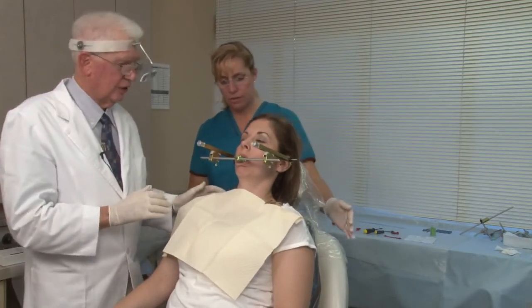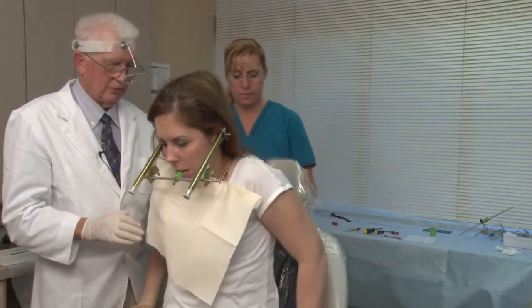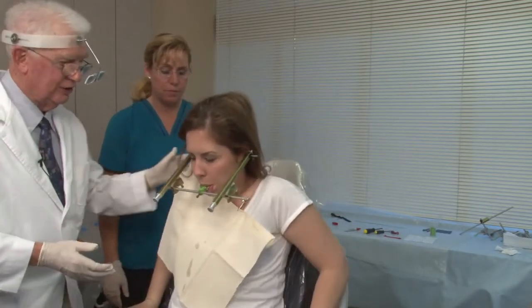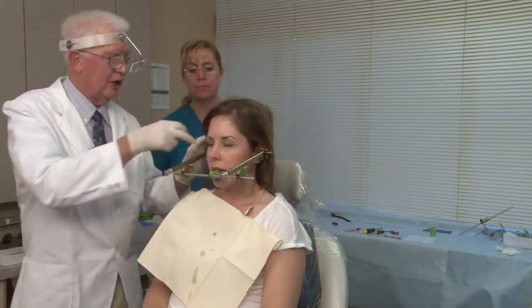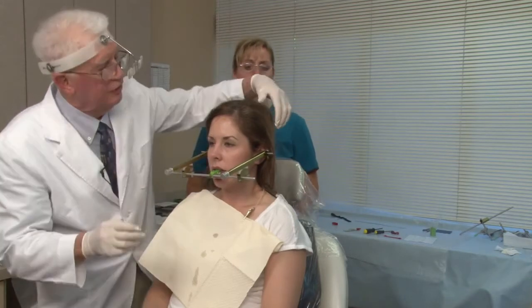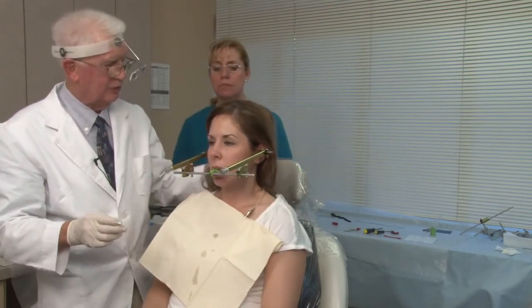Is that it? Okay, now I'm going to have the patient scoot your bottom back against the chair. Feet, no, don't cross your feet or anything like that. The hair has to be totally relaxed. You can't pull on the hair, because if you pull on the hair, that moves the skin. So the hair has to be completely loose.